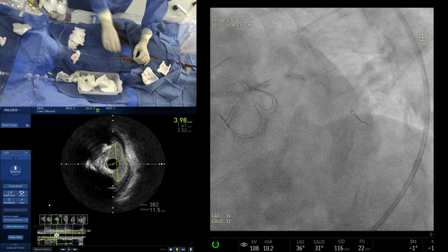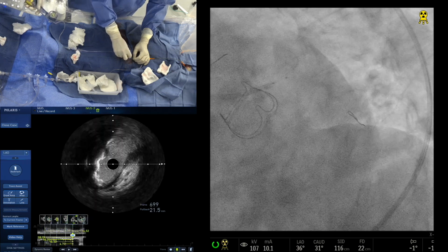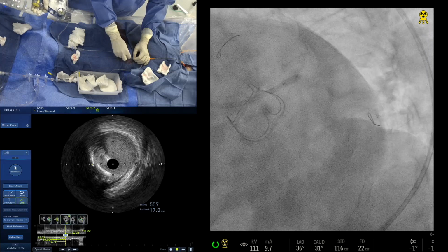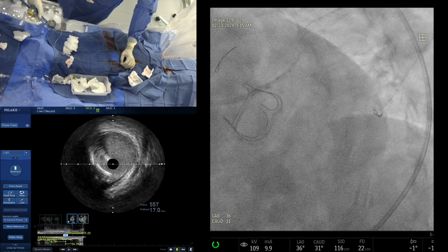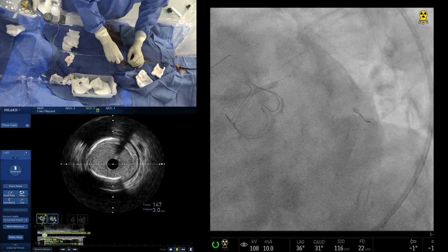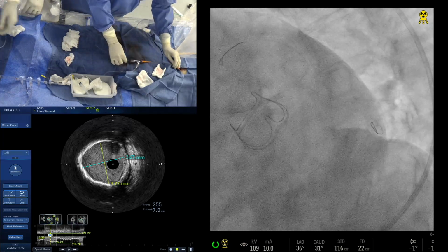Down. So therefore, just do the distal circ, distal left main a little more. Go. Yeah, here. So it's better to go for the two-stent strategy. Yeah, two-stent strategy. Yes. Better to go to the two-stent strategy. Yep. Because I think so. The left main ostium is not good. Yep. LAD. Yep. Okay. Ready? Now take a picture and let's take a decisive picture of everything. Ready?